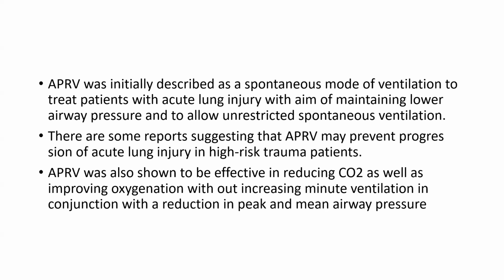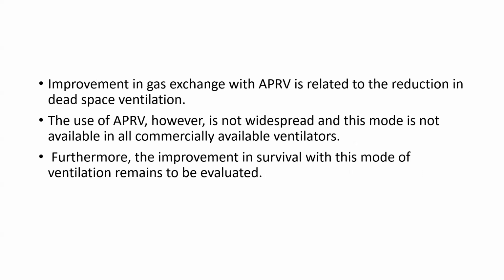APRV was also shown to be effective in reducing CO2 as well as improving oxygenation without increasing minute ventilation, in conjunction with the reduction in peak and mean airway pressure. Improvement in gas exchange with APRV is related to the reduction in dead space ventilation. The use of APRV, however, is not widespread and this mode is not available in all commercially available ventilators. Furthermore, improvement in survival with this mode of ventilation remains to be evaluated.